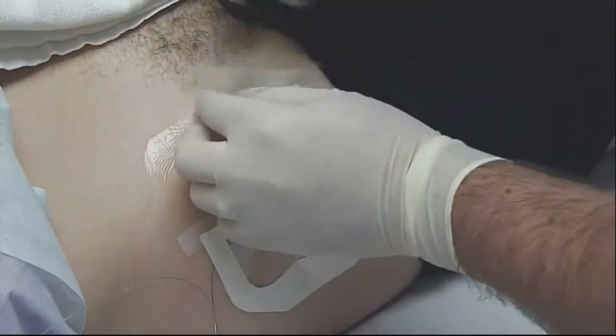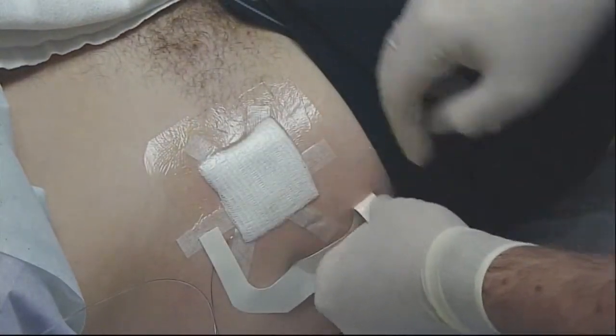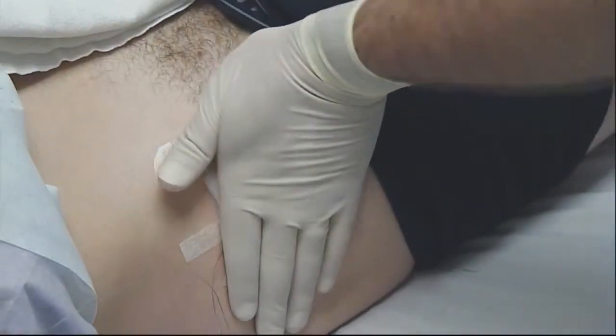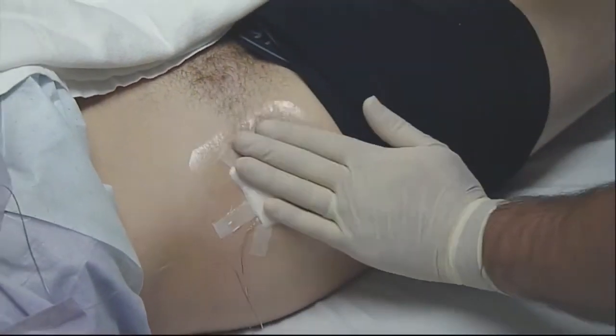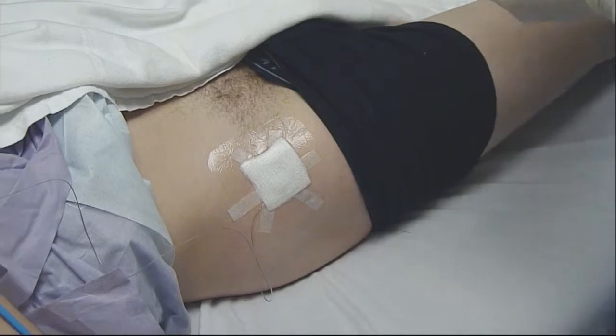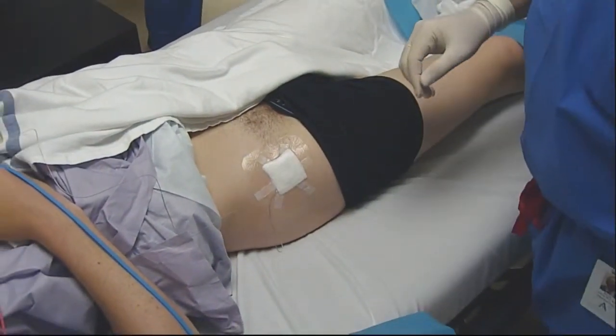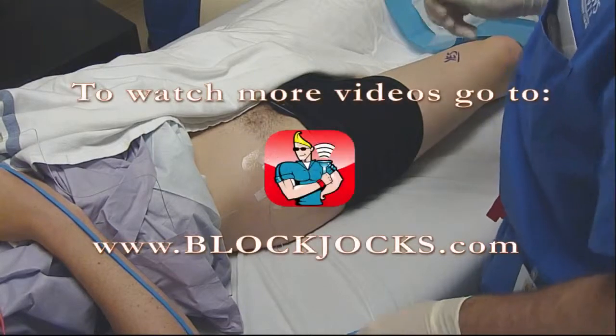The leakage isn't usually a problem — it can be a little bit of a nuisance and get the sheets wet at night, but most of the time the catheter is still going to work okay despite a little bit of leakage. I'll just apply that and that will do it. It should be a nice solid block and remain in place for the three or four days we have that catheter in.